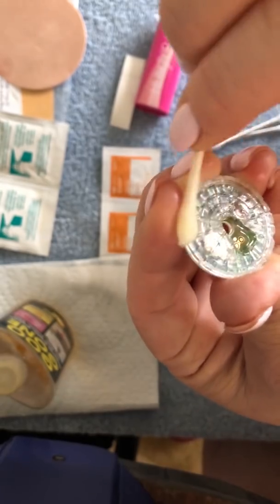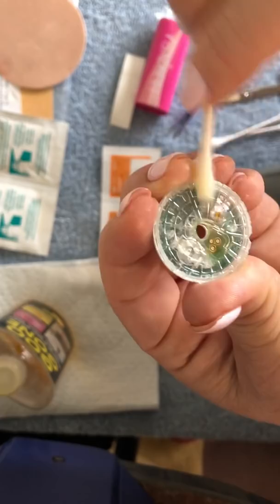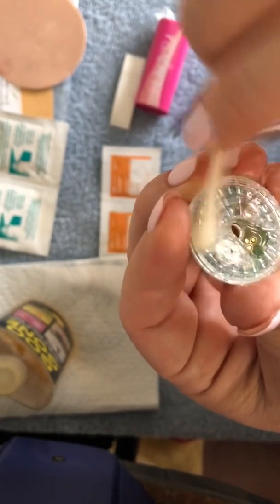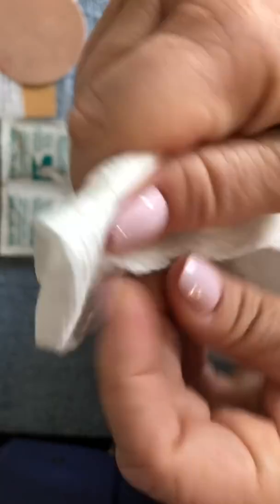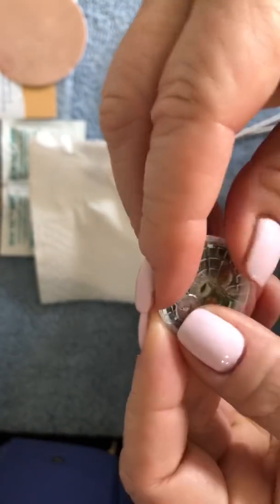Okay? And just make sure, like I said, be careful of the little triangle thing and try not to get too much stuff in there. Okay? All right, so then what I'm gonna do is I'm gonna take my paper towel and I'm gonna wipe it down. Okay? Make sure I get all of that off. Then what I'm gonna do is I'm gonna feel if there's any more tackiness on there.